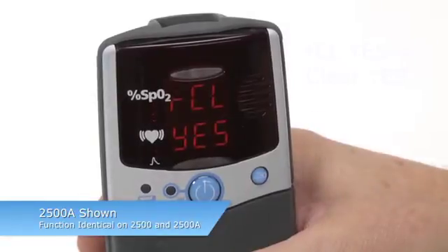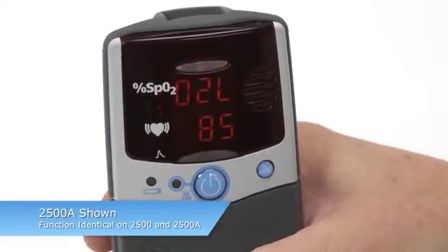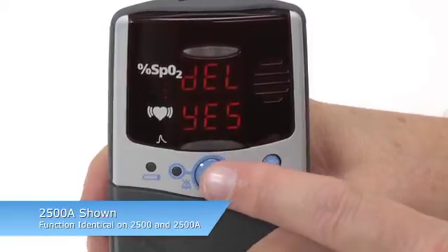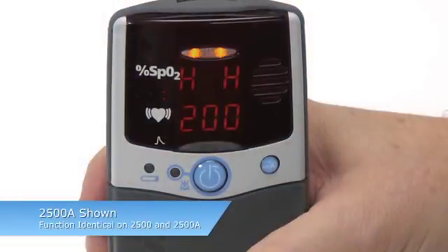To clear memory, press the ADVANCE key until you see CLEAR YES. Then press the ON-OFF key to perform that memory function. DELETE will appear — confirm that you want to clear by pressing ON-OFF again. You will automatically exit Setup Mode.